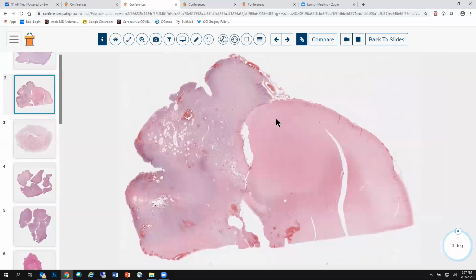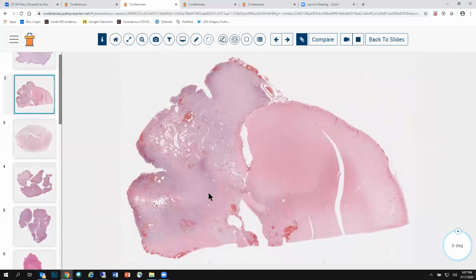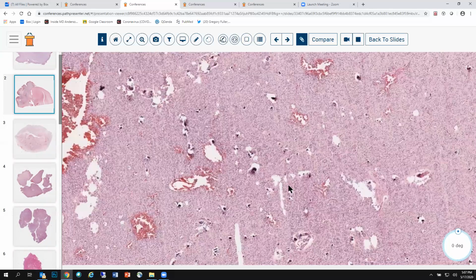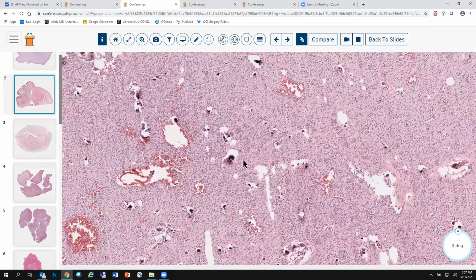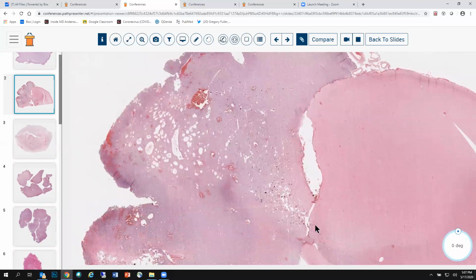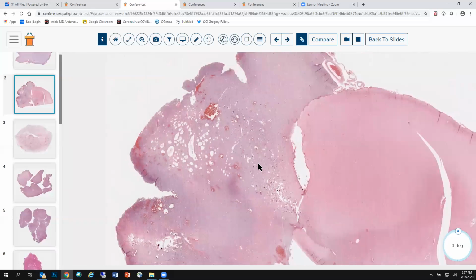Now this is very similar, unknown case number 2. Again, it looks like cortex and white matter, very hypercellular, microcysts. There's one difference here. We see prominent calcifications, and the calcifications are in the cortex. So if you were to follow these, look at the shape of the calcifications. They follow the cortical ribbon. That would have shown up as gyriform or curvilinear calcifications on the preoperative CT and MRI scan, gradient echo, susceptibility weighting, etc. That, in the context of the diffuse glioma, is very suggestive of oligodendroglioma.